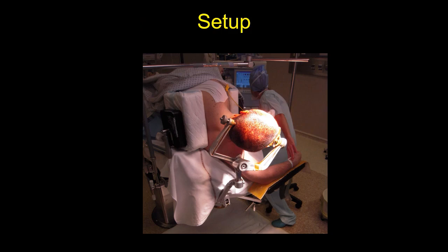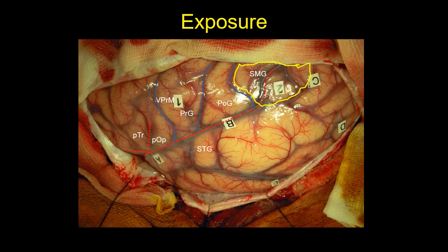Shown here is a typical setup with the patient in a lateral position and the head immobilized in a Mayfield head holder. Here is a typical exposure one might see during intraoperative mapping.